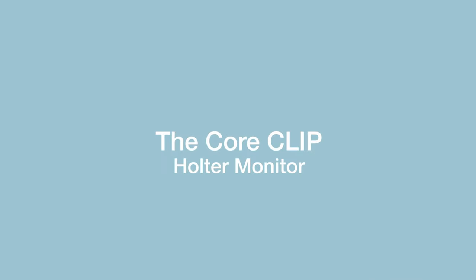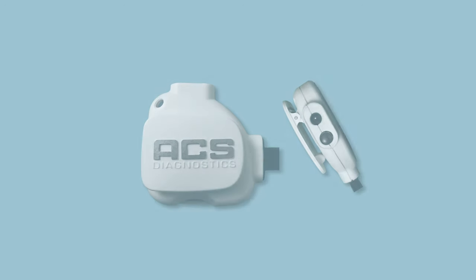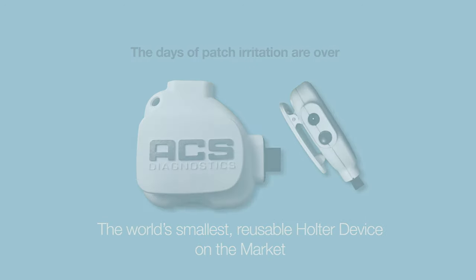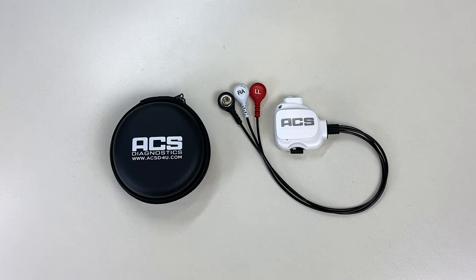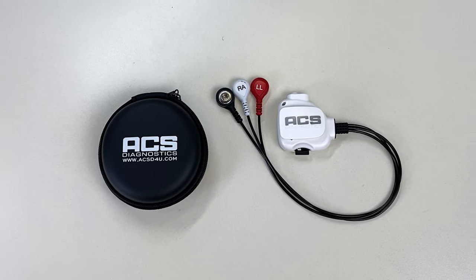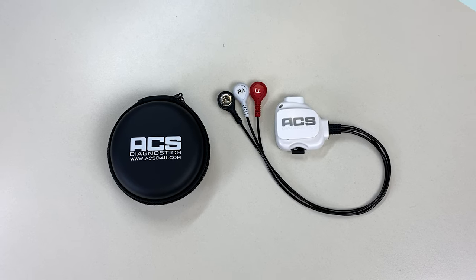The Core Clip by ACS Diagnostics is the world's smallest reusable holter device on the market. The single button design is quick and easy to use for device startup and patient event notice. The clip is both intuitive and simple to operate.